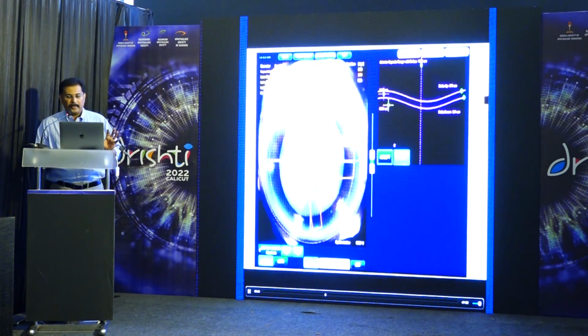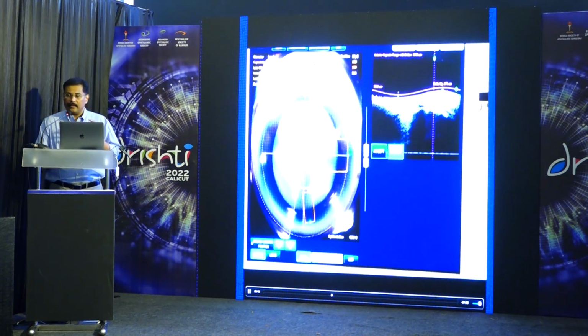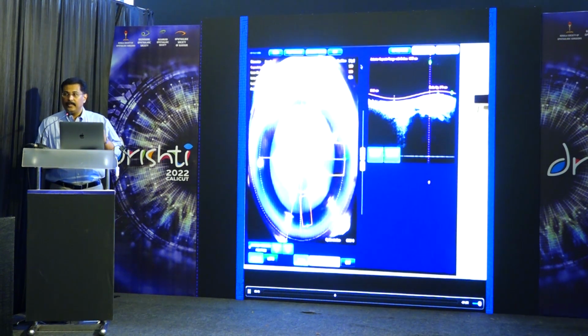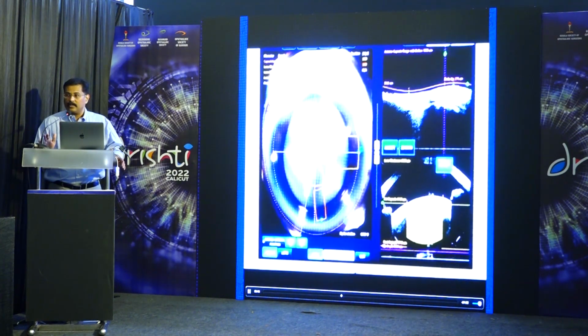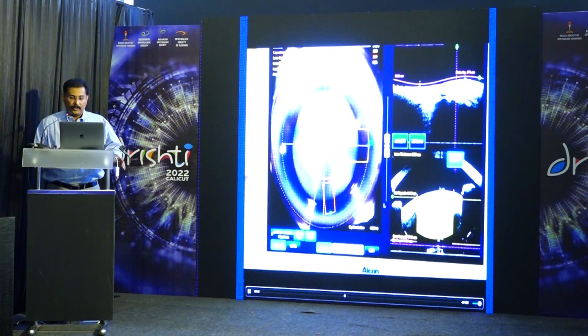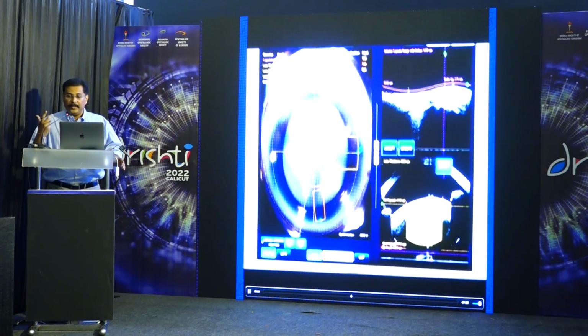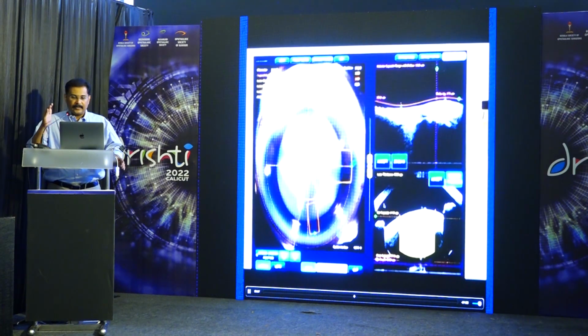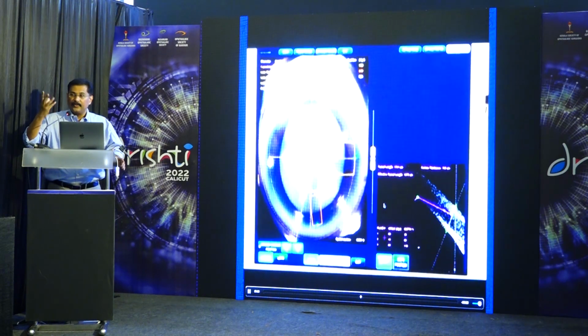Here the problem is that he has an intumescent lens with clear or white fluid on top of the nucleus. So here you cannot focus on the nucleus, that is out of the question. You can do a capsulotomy, but the problem is the cortex is fluidy. Once you cut, it starts from below, and once it completes, this fluid starts coming out.